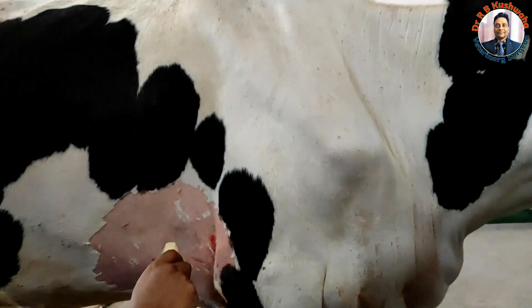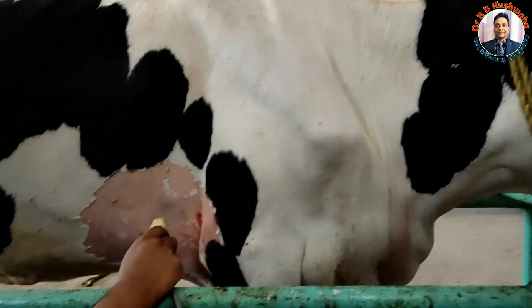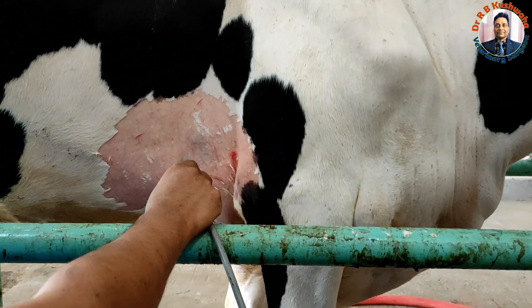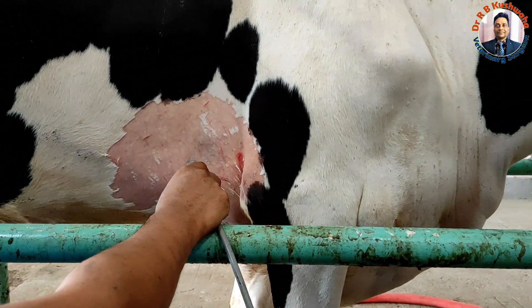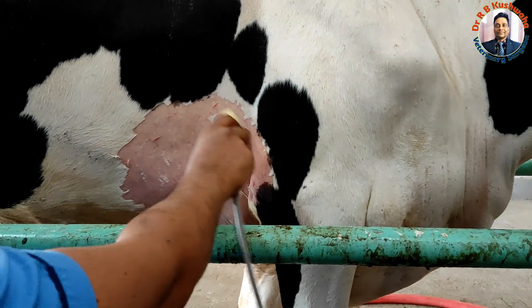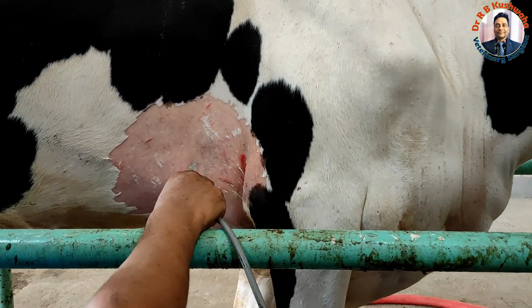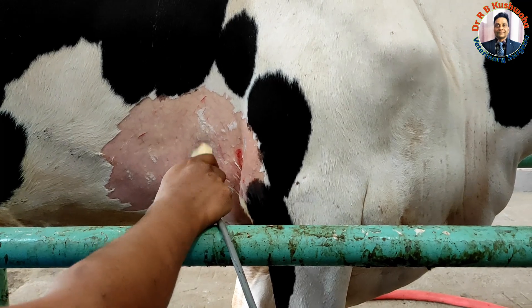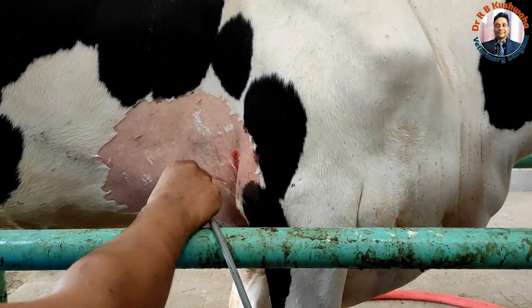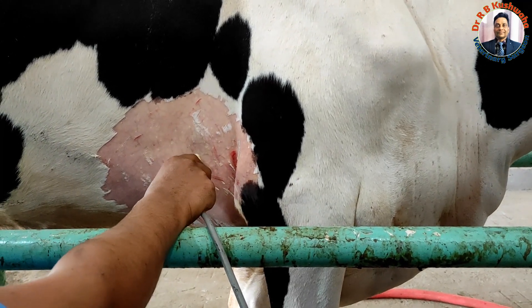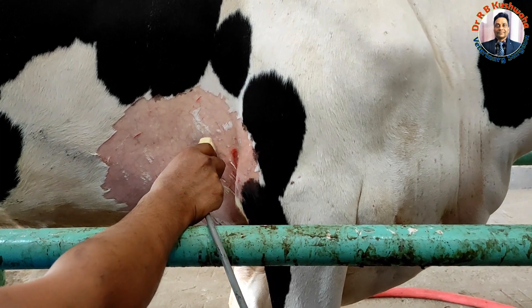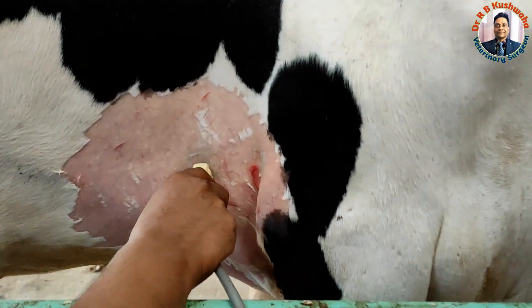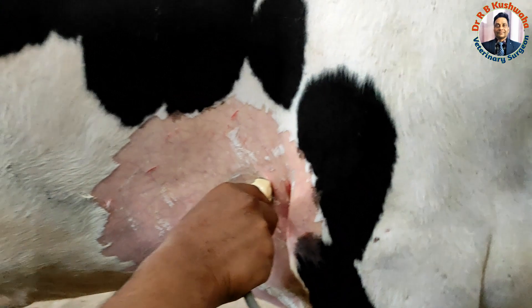We took radiography, but in the radiographs nothing was visible — no foreign body was seen. So we planned for ultrasonography. For ultrasonography of the thoracic area, if you are suspecting traumatic pericarditis, you should scan the 6th intercostal space. We applied jelly as an acoustic coupling medium and prepared this area for the scan.